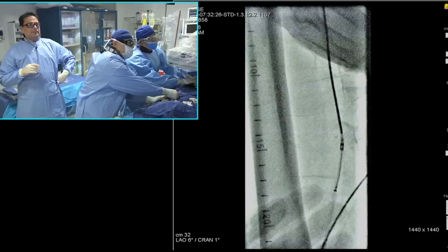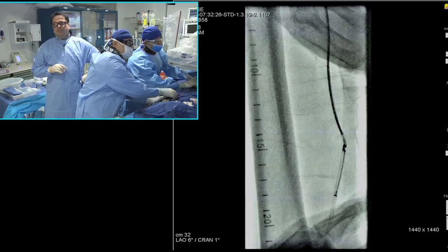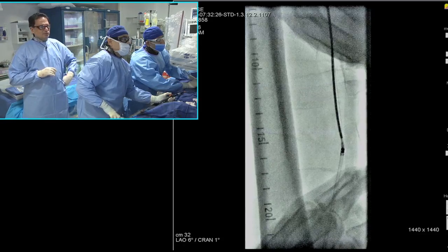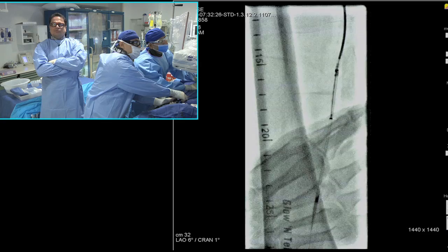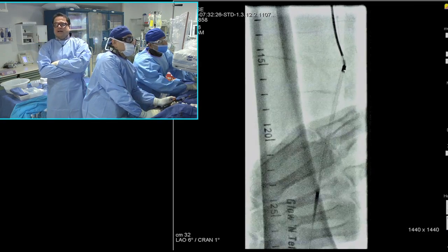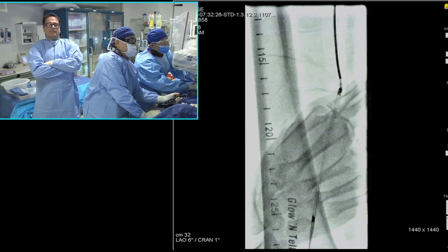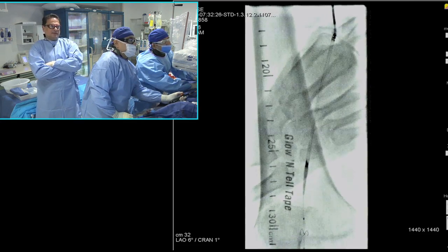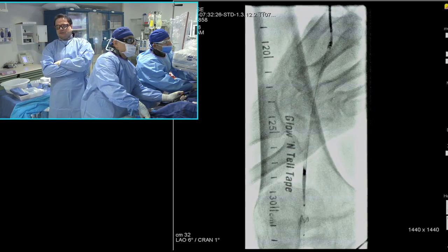Well, Vishal, I know I haven't told you about this yet, but we're looking at our filter use here at Sinai. We've taken 500 consecutive filters done over the last, I think, 2 or 3 years. We were looking at what our filter capture rate has been, meaning the macroscopic embolic rate, as well as where the filter really captured things. By my experience, which is anecdotal, but I believe in it and it has done us justice in the past, I think there's a role for filter in certain types of lesions.